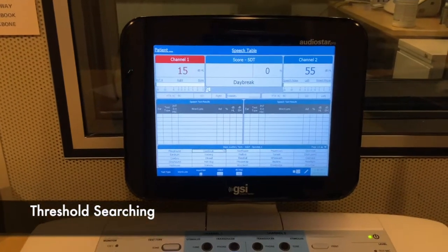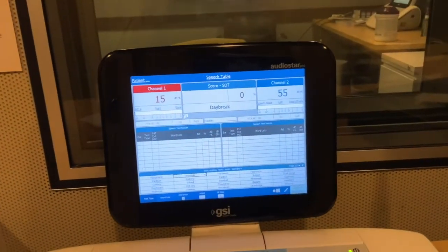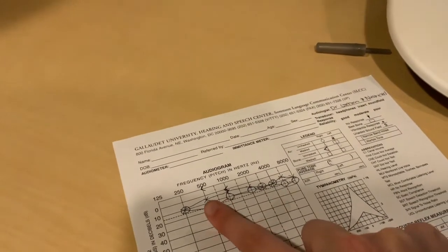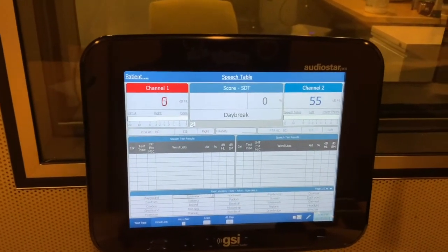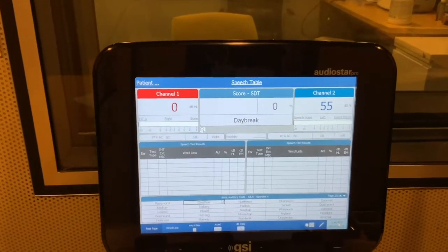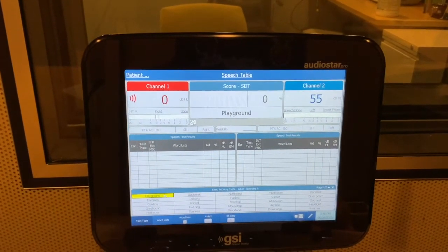Right, so now that we have it all set up for SDT, we are going to look at our audiogram and see the thresholds that we're working with in the ear that we're testing. They're all around 10 dB, so we are going to put a starting level at 0 dB because we want to do it 10 dB softer than our threshold. Starting at 0, we're going to present a word.